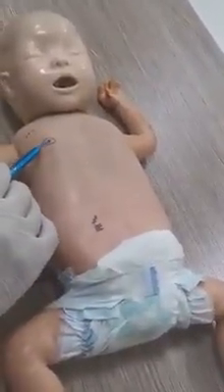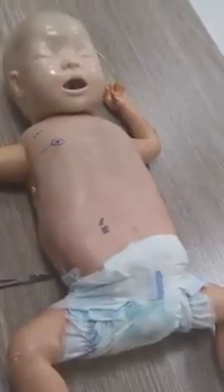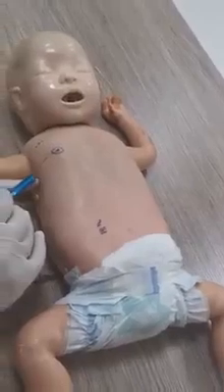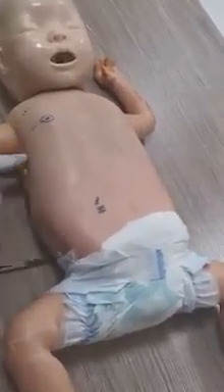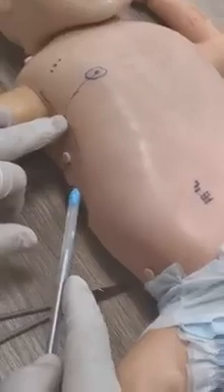Okay? So this is the anterior axillary line and this is the fourth intercostal space. So this is my site for insertion. So I will go from this side. Suppose I know that I will go from this side now because this is a right pneumothorax.